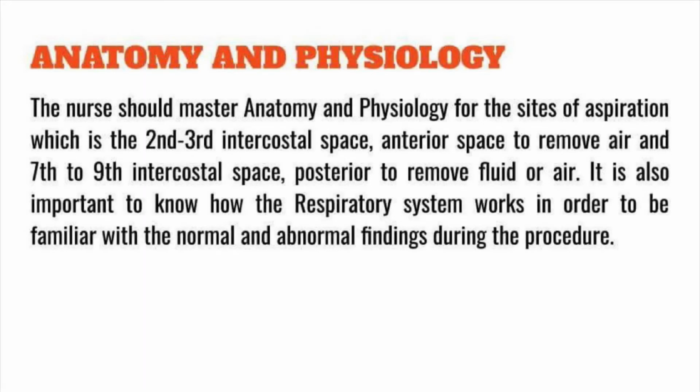The nurse should master anatomy and physiology for the sites of aspiration, which is the second or third intercostal space, anterior, to remove air, and the seventh to ninth intercostal space, posterior, to remove fluid or air. It is also important to know how the respiratory system works in order to be familiar with the normal and abnormal findings during the procedure.